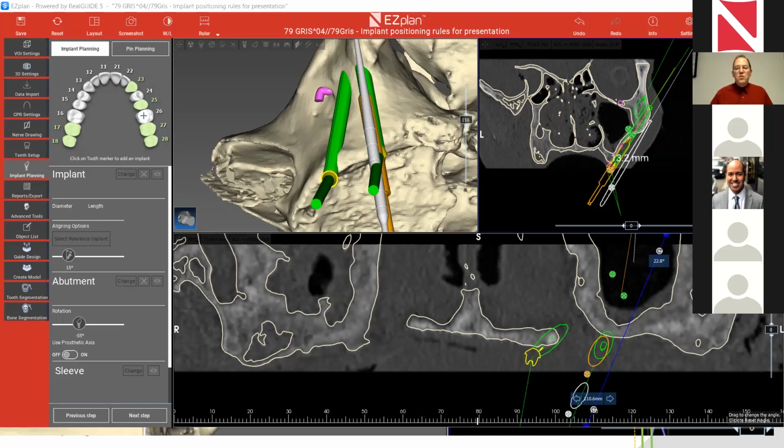That's why they were a little bit aggressive. But now we changed the drills, and we changed the angles of the flutes of the drill, so now the drills are cutting nicely and not aggressively. I don't know if you have the new drills or not, but let's talk afterwards and see what we can do.